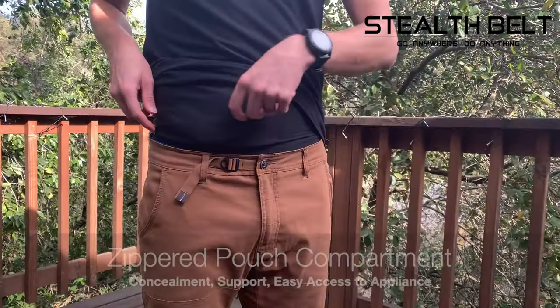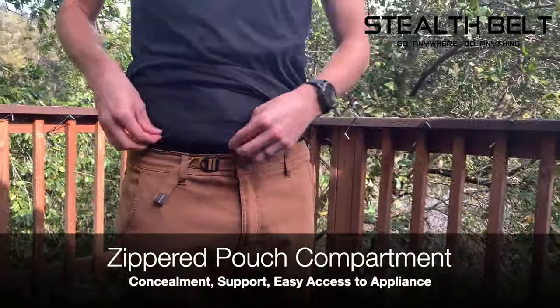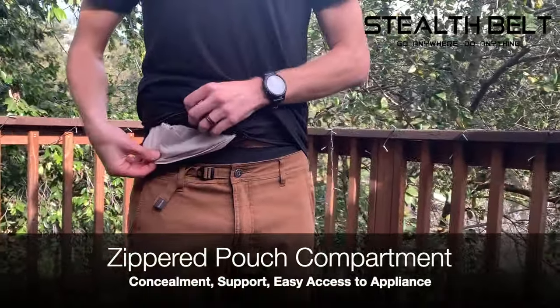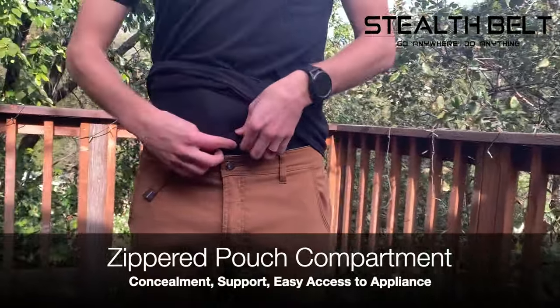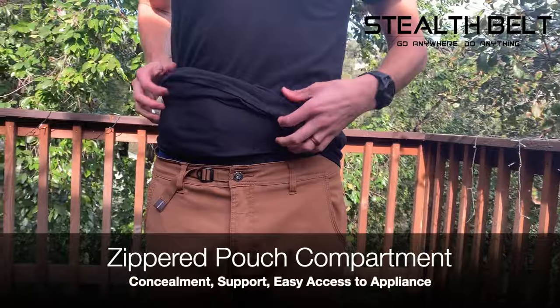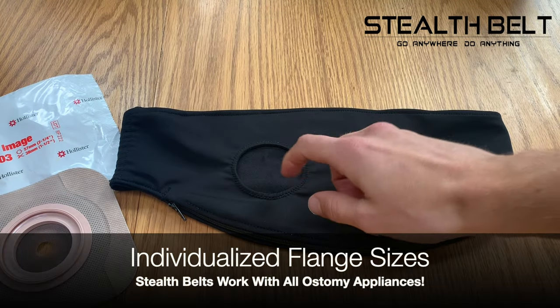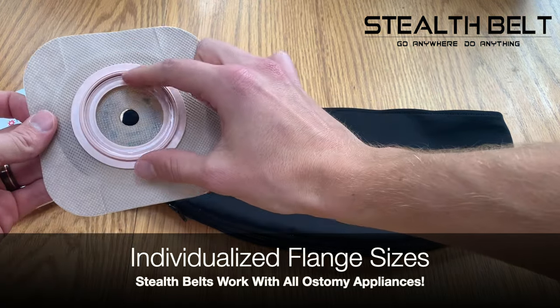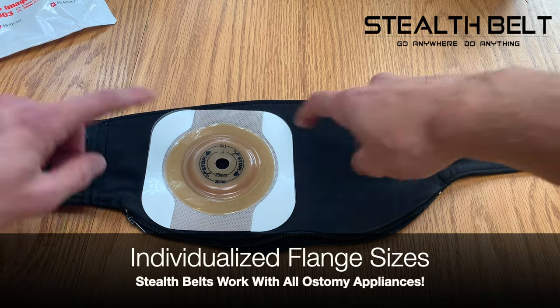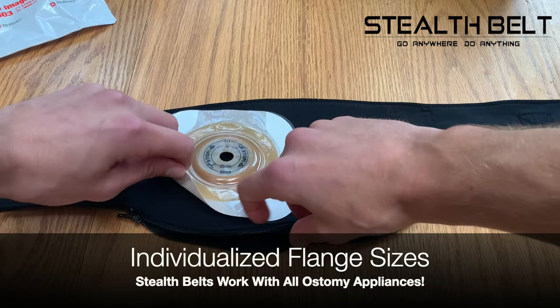Stealth belts feature a zippered pouch compartment that completely conceals the appliance, supports the weight of the bag as it fills, and allows for easy access to the bag when it's time to empty. Stealth belts also feature a flange hole that is made to match the size of the ostomy appliance, so that the bottom layer of the belt can apply gentle pressure to the adhesive.